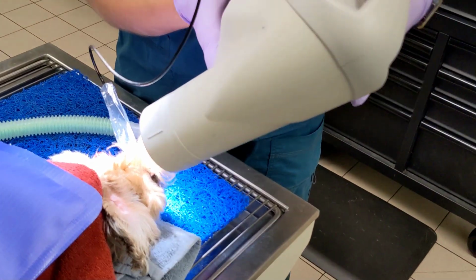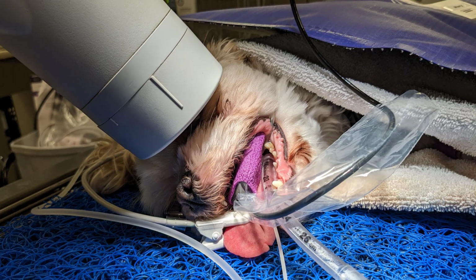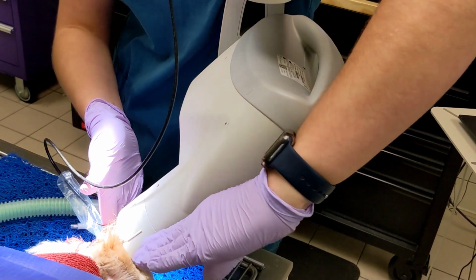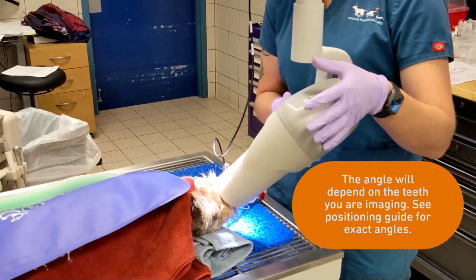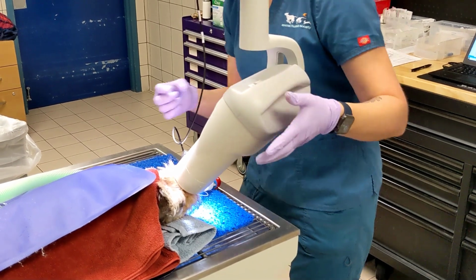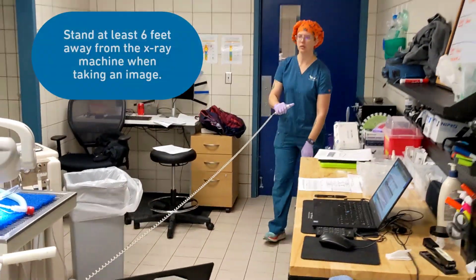Set my angle to try to get that image. I usually have to shoot through the eye on these upper teeth up here. So if you think that plate is sitting like this, right? Look at where my beam is. I'm hitting that beam about this, and that's about 45, right? So you have to do some math in your head. You got to look at the angle of that plate, and then how the beam, which is going to be coming out here, is going to hit that plate. You're aiming for usually around 30 to 45, depending on the teeth you're taking shots of. So you aim it at that plate at about a 45-degree angle to get the image you're looking for. Line it up, so you know you're lined up on the plate here, you're lined up on the plate here. I'm going to take this image from way over here, okay?